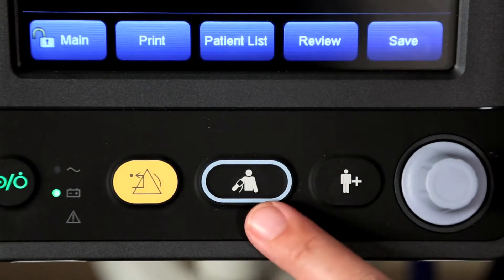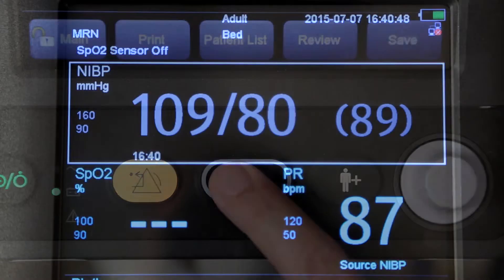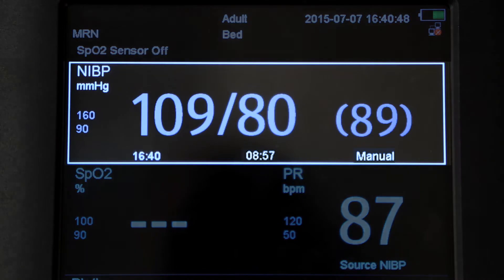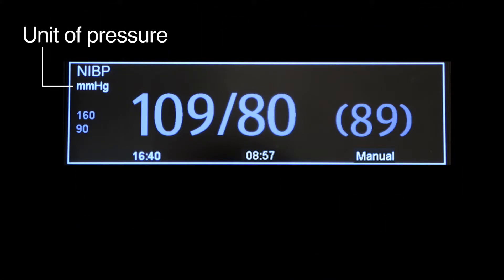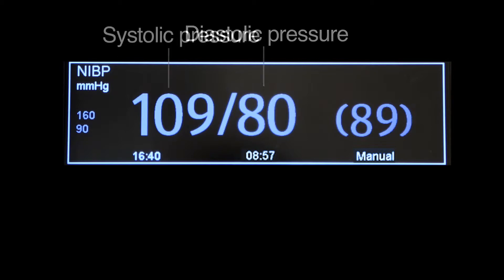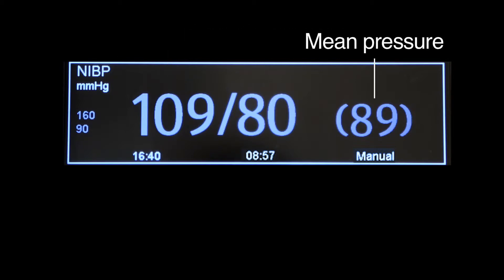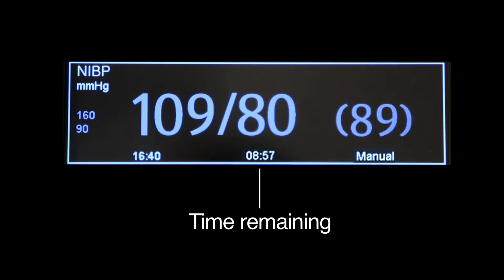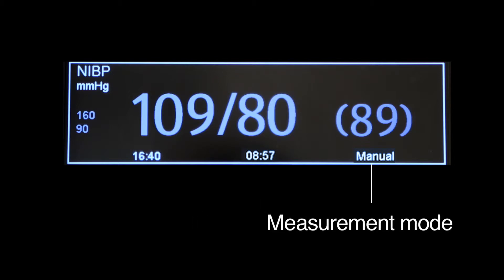To start the NIBP measurement, press the blood pressure hard key on the monitor's front panel. The NIBP display shows the unit of pressure — millimeters of mercury or kilopascals — systolic pressure, diastolic pressure, mean pressure obtained after the measurement, cuff pressure obtained during the measurement, time of last measurement, time remaining to next measurement, and measurement mode.